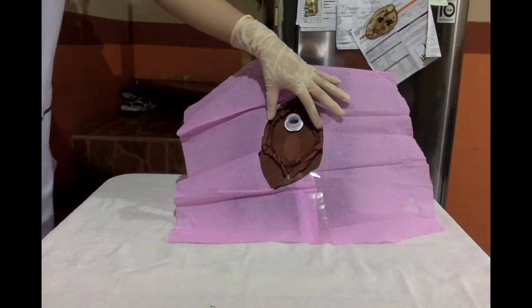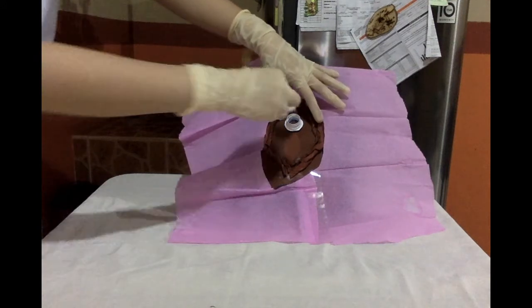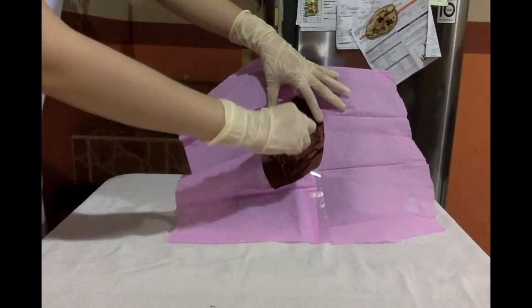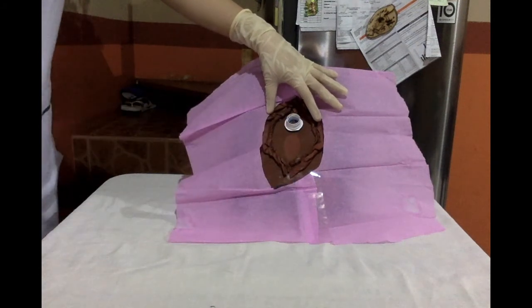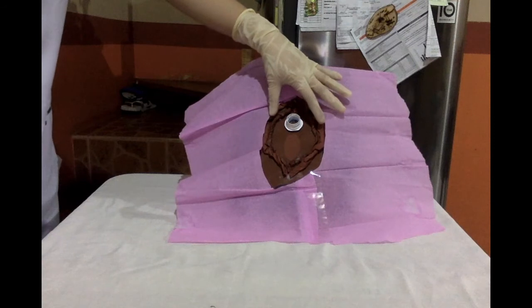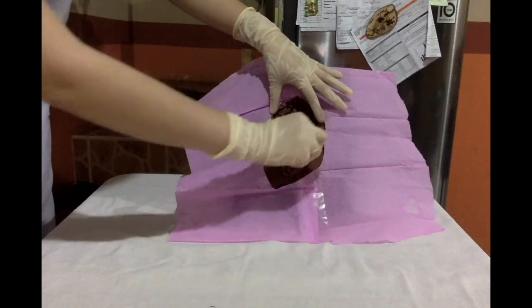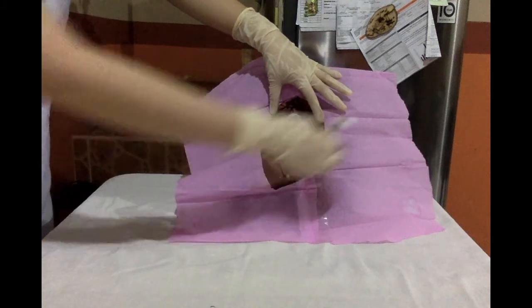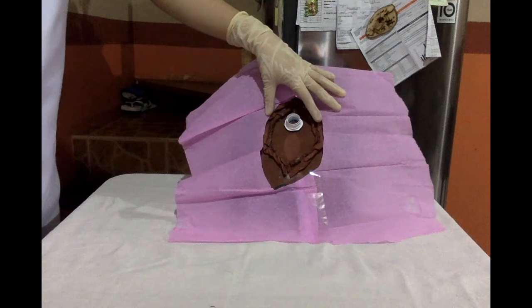Then discard. Wipe the center. Again. Discard. Repeat it. Discard.